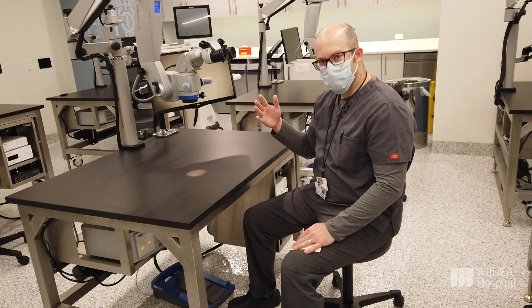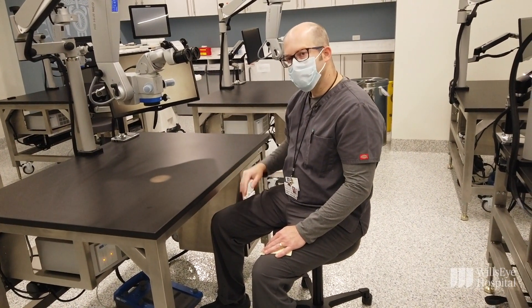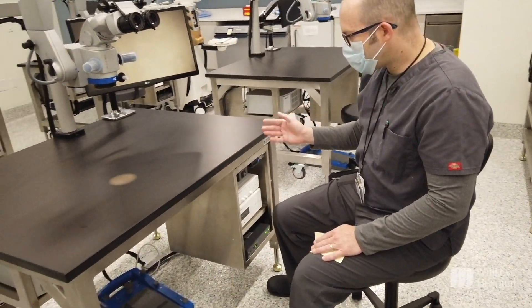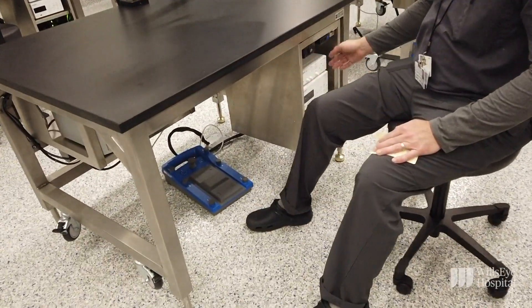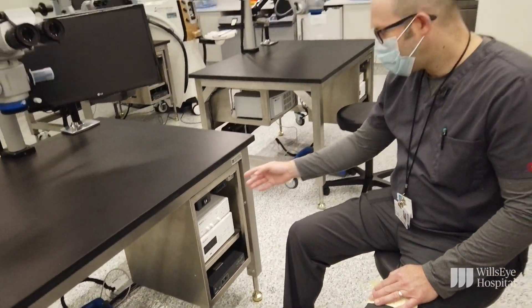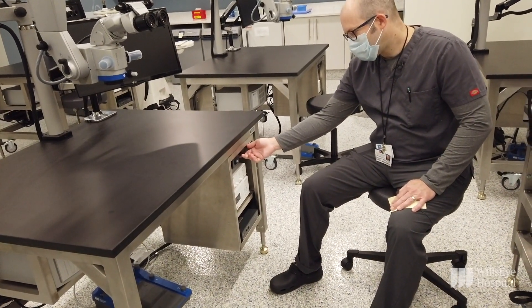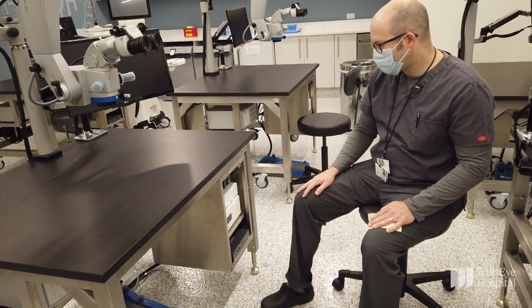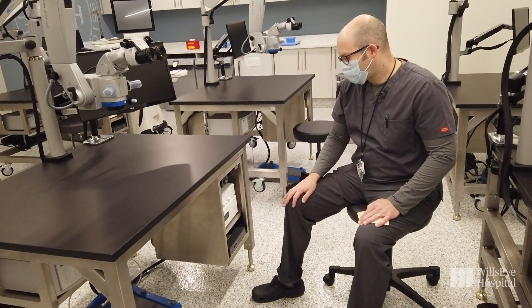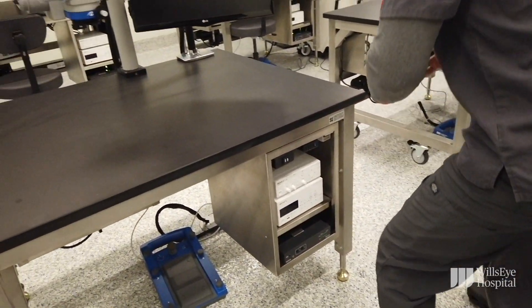Instructions for the microscope are all housed in our cabinet, which I'll show later. Each microscope is integrated to the video system. If you have any questions about instructing in the lab or displaying video to different stations, we can go over that. Once you're done with the microscope station, make sure you turn off the light and then power down the switch. Here is a USB box — it can be used for charging cell phones and other devices. Your recorder should only go into the Sony hard drive recorder.